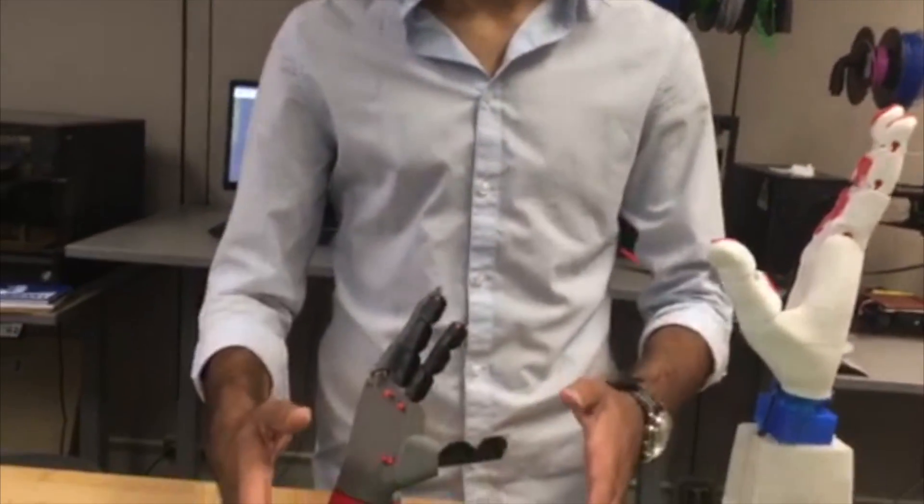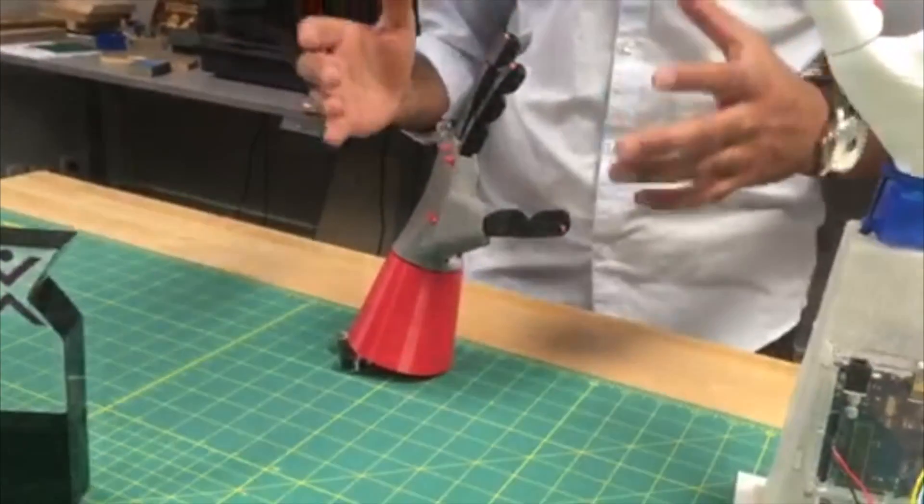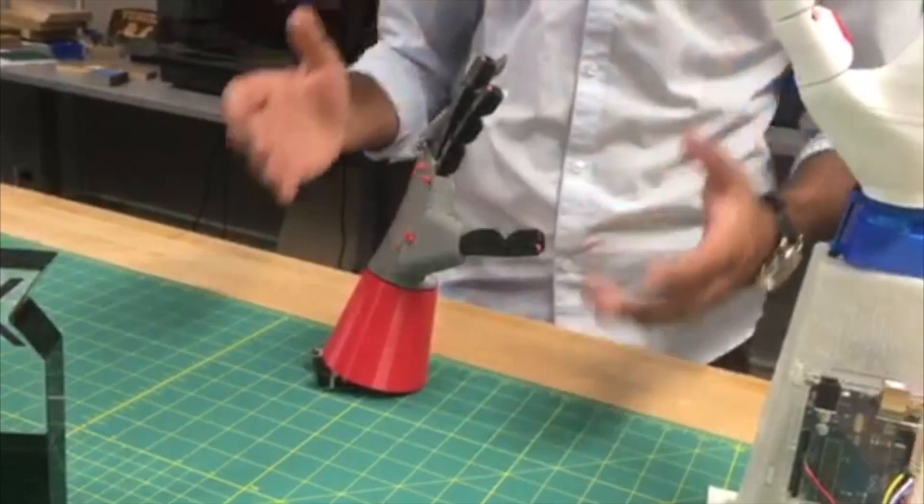That led me to think it might actually be pretty easy to build something that someone could use as an actual hand. But the missing link was being able to build something highly precise and highly functional. The way we solved that was by putting a camera in the palm of the hand that is able to identify what the object is, and the onboard computer does all the calculations as to what the best grip for that object would be.